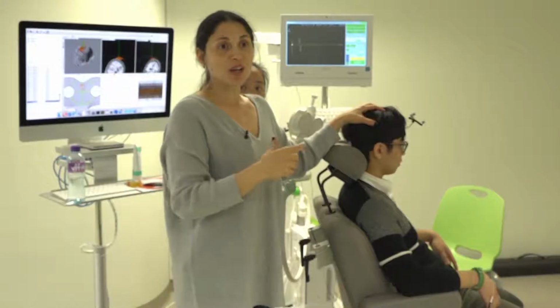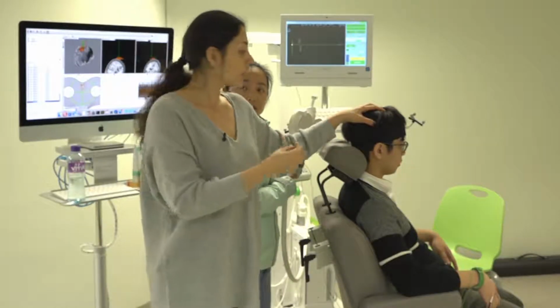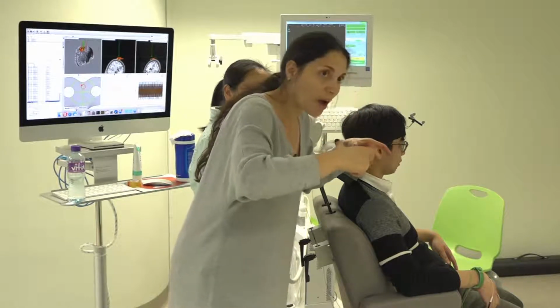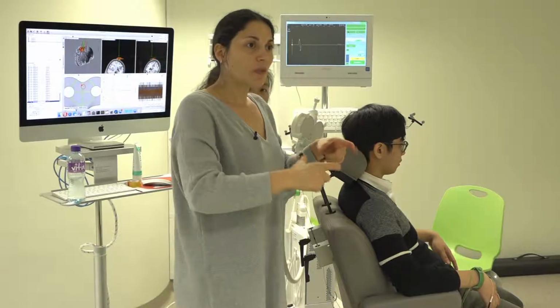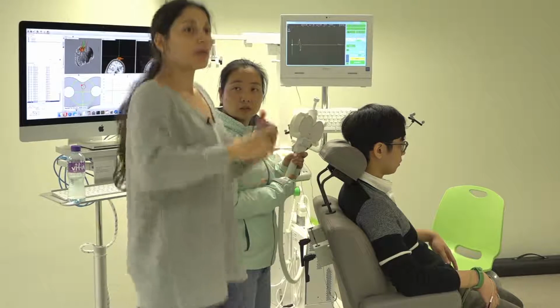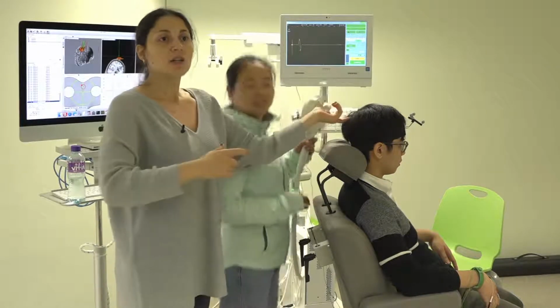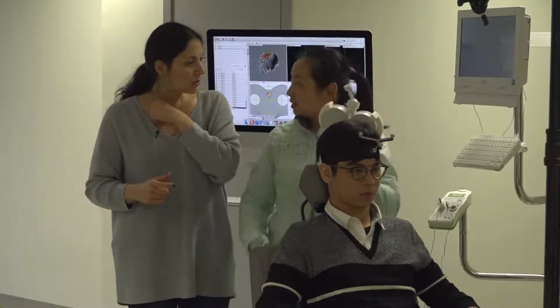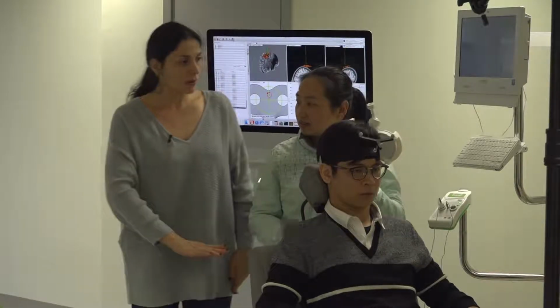For me today, probably that was one of the reasons why it was more difficult, because he seems a little bit high, so I cannot see the coil from up top to have better control of the coil. So for her, I will use a step so that she can see from up and hold the coil, because she cannot see here. If I'm not high enough, you need to have a step, something that you can step on.